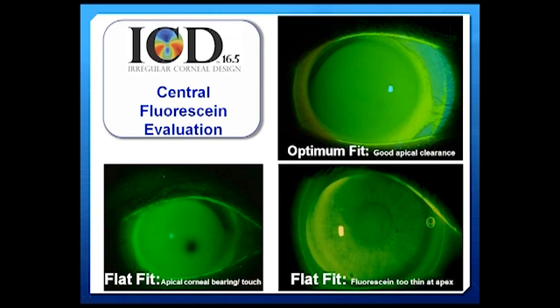If that lens goes on eye and has central touch in the central clearance zone, you know you need to go back to the fitting set and add more depth. If that lens has bearing, it would be likely you need at least 300 microns more sagittal depth. So if you put on a 4200 micron lens and it has central corneal touch, then put on the next lens as a 4500 lens.